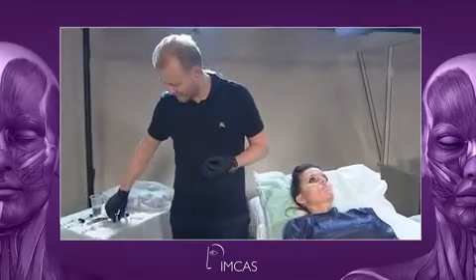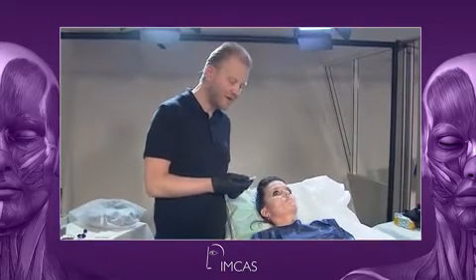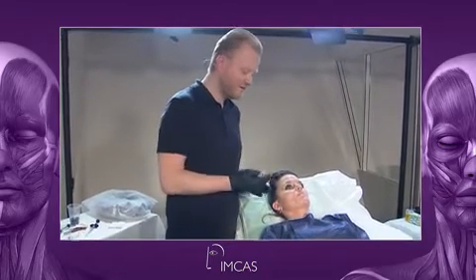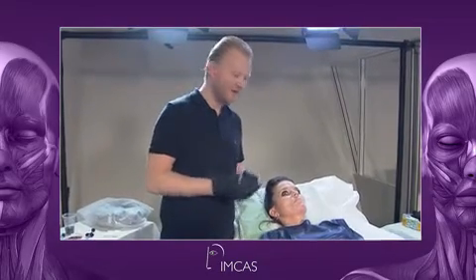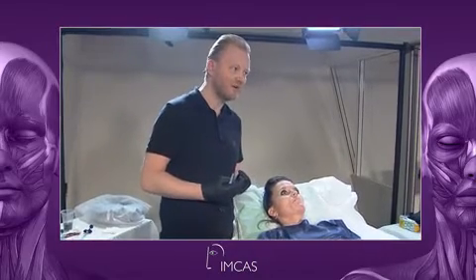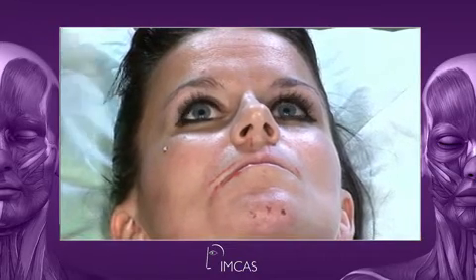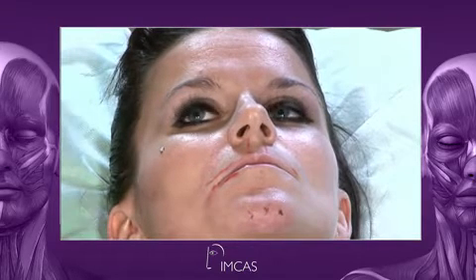I love to work with a microcannula. This is one of the reasons, but not the only reason. The microcannula actually, for me, becomes in a way my three-dimensional GPS. By using the microcannula, I can differentiate the different layers that were just shown to us. I want to avoid intramuscular injection, because that also creates a high risk of nodules and not as nice results. I don't want to inject too superficially and have visible filler, but I just want to be on top of the orbicularis oris muscle, which is a layer I can find with my microcannula.